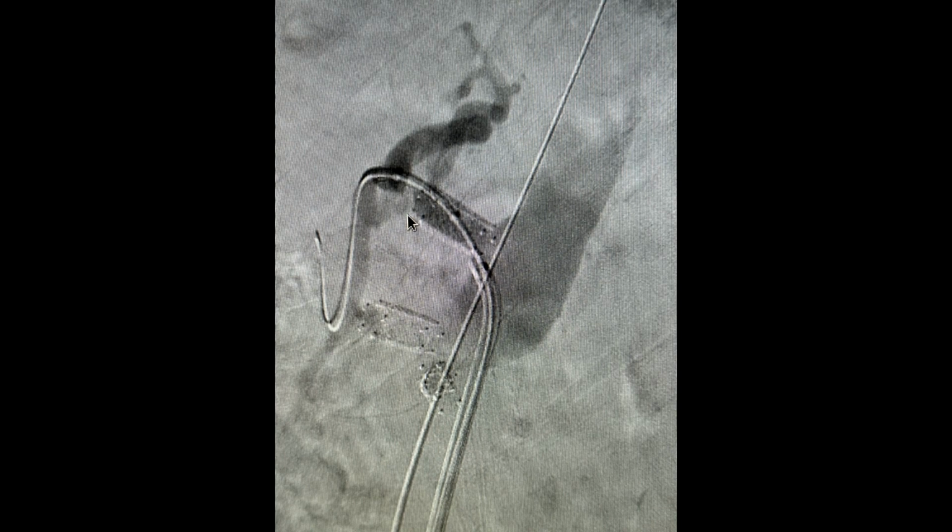The next part of this case is the most anxiety producing. Essentially, you bring a covered endograft in here and you deploy it, and you cover up all your visceral arteries and renal arteries. And so now they are all ischemic. And so very quickly, choosing to revascularize our superior mesenteric artery first, we brought a laser catheter here and burned a hole right through this graft.